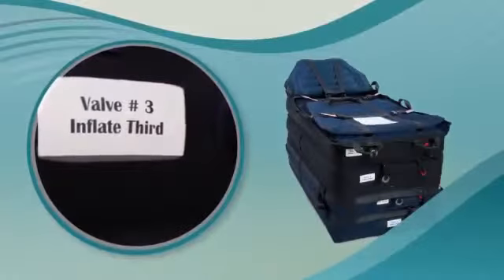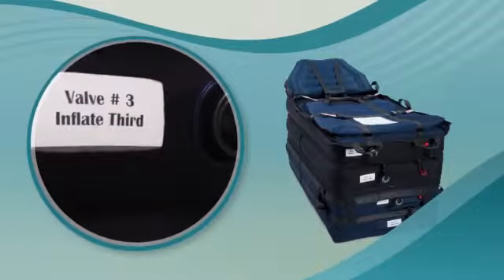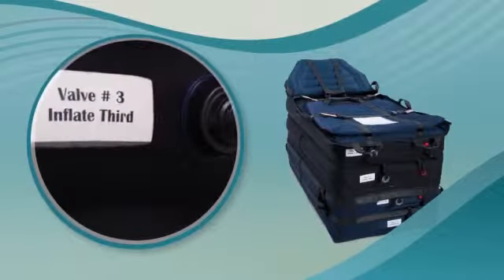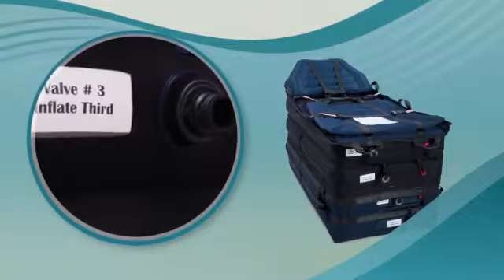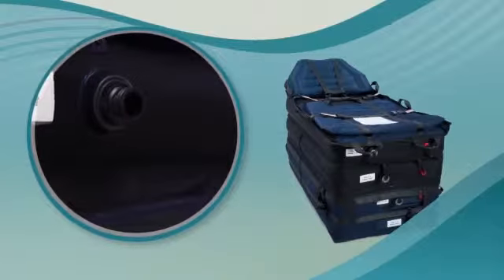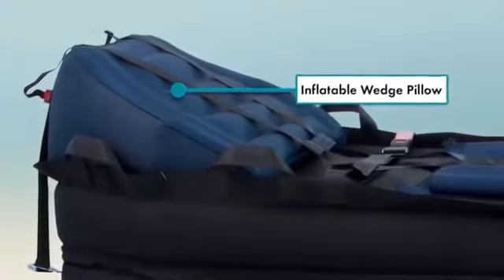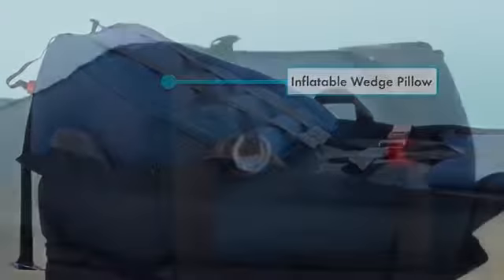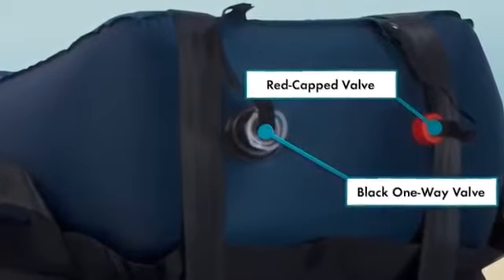The chamber valves are labeled and numbered from 1 to 4, with the chamber labeled valve 1 being the closest to the floor. It is not necessary to cap the black valves unless the patient will remain on the inflated device for an extended period of time. Each chamber also has a red capped valve to be used for quick deflation. There's an inflatable wedge pillow for patient comfort at the head end that also has one black one-way valve and one red capped quick deflate valve.